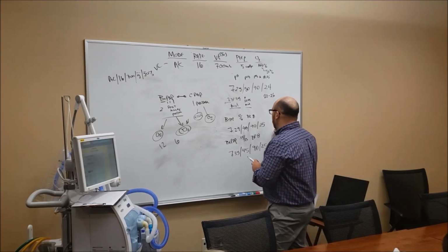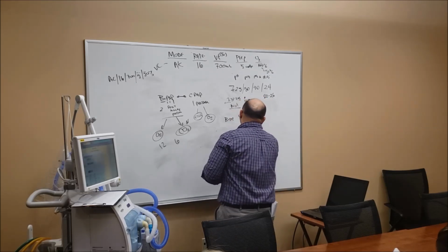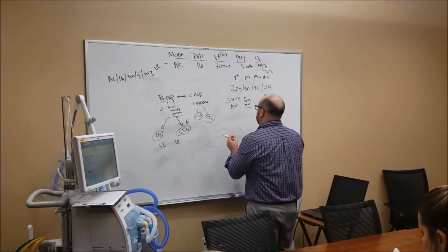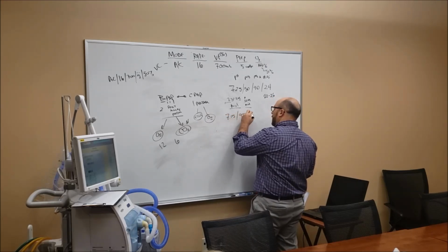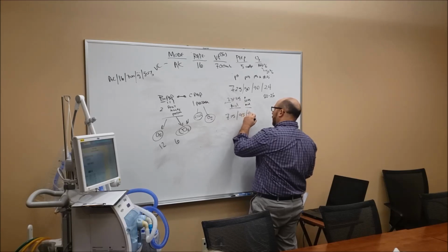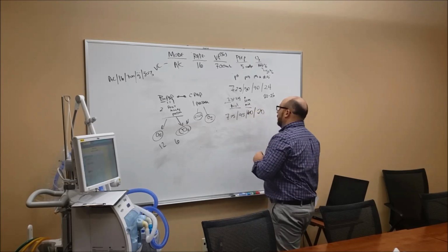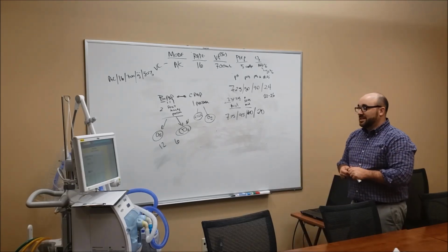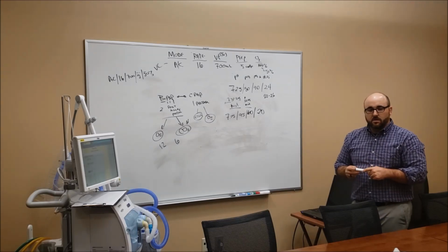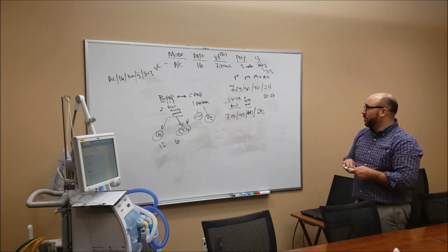So let's say we go back and have this blood gas. This is going to be pretty poor. You can't always just look at the numbers and say they're going to be on a ventilator or on a BiPAP. Okay, this is a pretty bad one: 7.15, 95, 60, and 20. First of all, pretty bad acidotic, right? What's causing it?